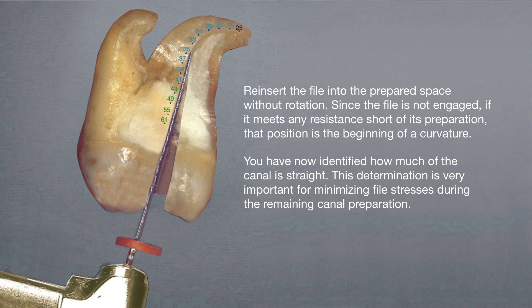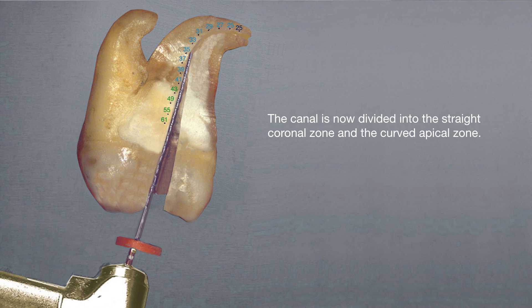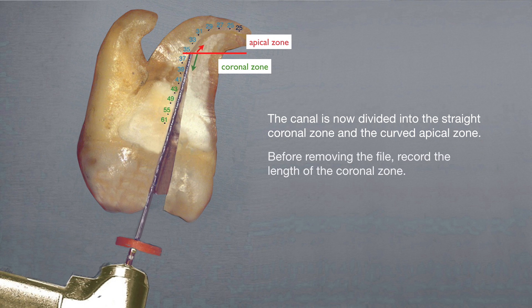You now have identified how much of the canal is straight. This determination is very important for minimizing file stresses during the remaining canal preparation. The canal is now divided into the straight coronal zone and the curved apical zone. Before removing the file, be sure to record the length of the coronal zone. In the case of this illustration, the measurement was 15 millimeters.